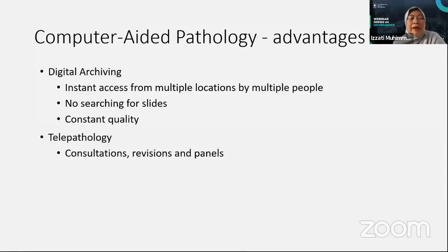And then, once the image is captured in good quality, it is constant quality, not deteriorated over time. Then it has potential for doing telepathology, which is consultation, revision, and panel review where the experts are on different islands or in different cities.